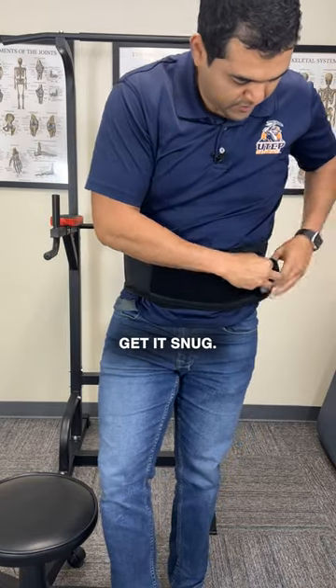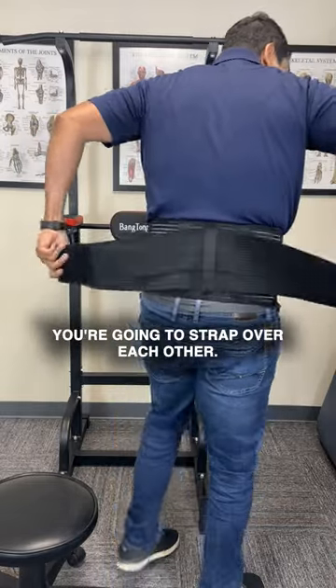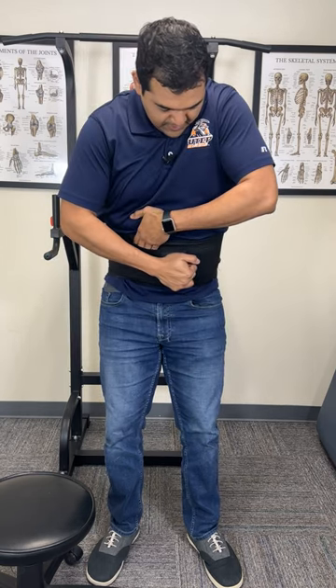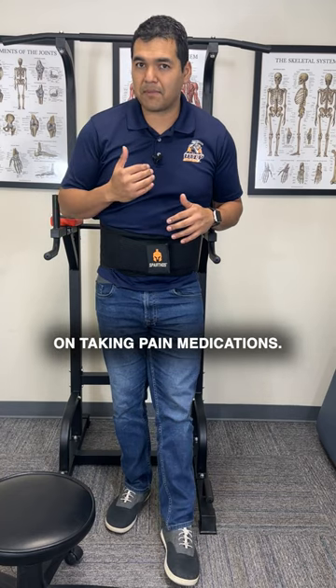So just get the velcro over, get it snug. Then you have these two straps — you're going to strap them over each other, one here and the other one here. This allows you to get back to your daily routine without having to rely on taking pain medications.